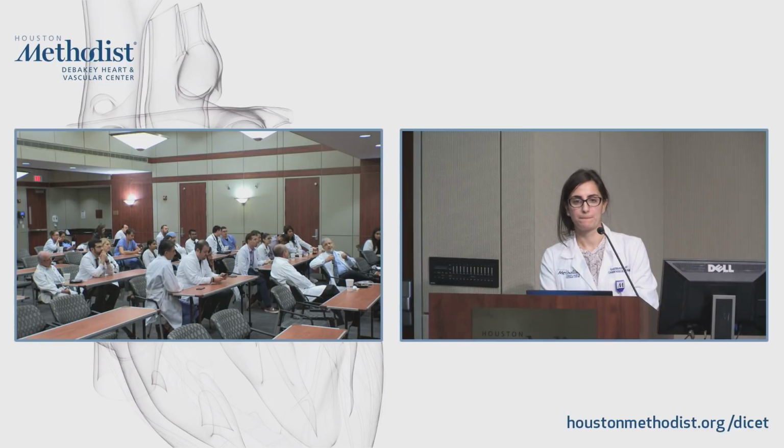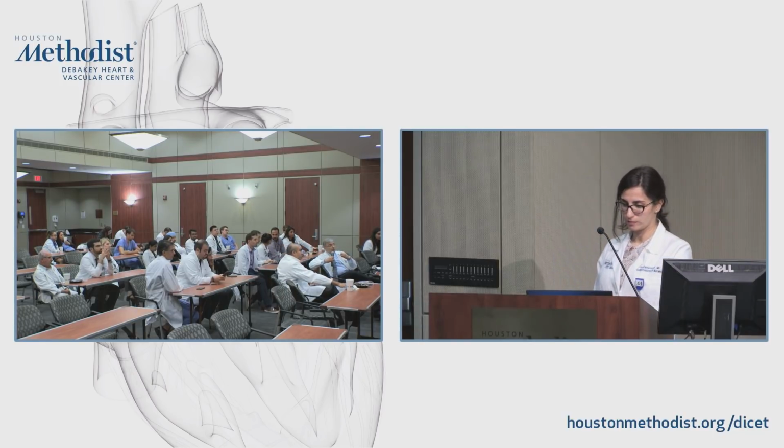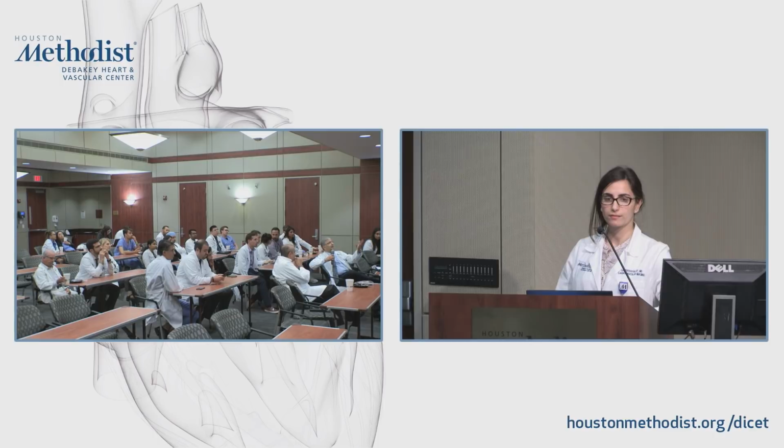I cannot tell, because of the first test, what additional information I get that is going to change my outlook. I'm really not sure of the situation. I don't know what else you're going to do. You could planimeter the mitral valve; you had a 3D you could planimeter from. You're going to look at ventricular function, left and right. I think the images were pretty decent to do that. You understand what I mean? I just don't know, and you don't have hemodynamics.